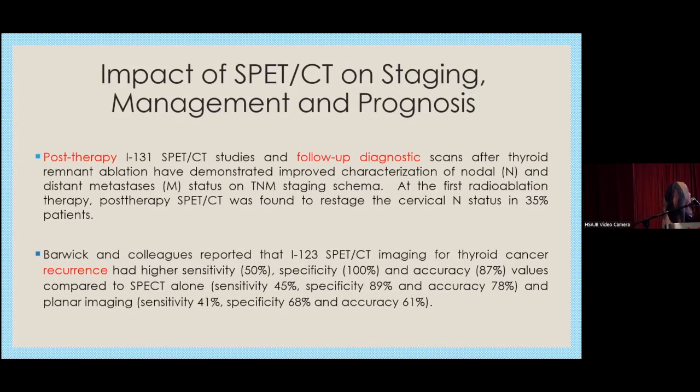So what is the impact of SPECT-CT on staging, management, and prognosis? Of course, post-therapy iodine SPECT-CT studies and follow-up diagnostic scans after thyroid remnant ablation have demonstrated improved characterization of nodal, as well as the M status on TNM staging. And at the first radioablation post-therapy, SPECT-CT was found to restage the cervical nodal status in about 35% of patients. And as you can see here, more of SPECT-CT usage is to remain a high specificity in detecting thyroid recurrence.